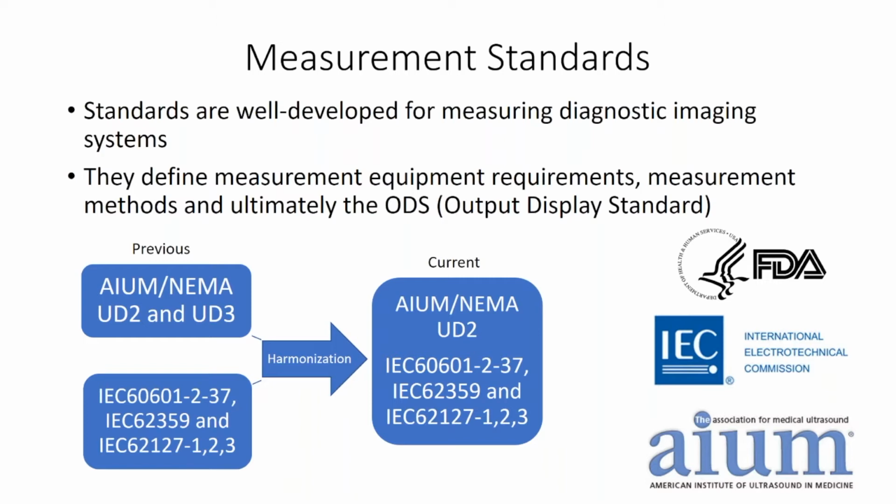Significant historical events in this field include, as part of the medical device amendments to the Federal Food, Drug, and Cosmetic Act for the U.S., the ultrasonic devices on the market prior to May 28, 1976 were measured at settings giving application specific equivalent levels.